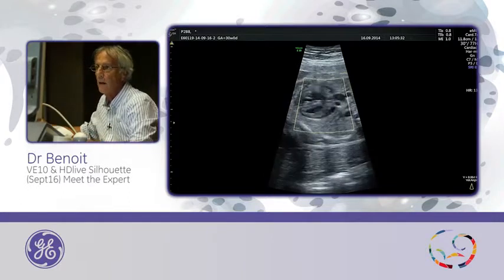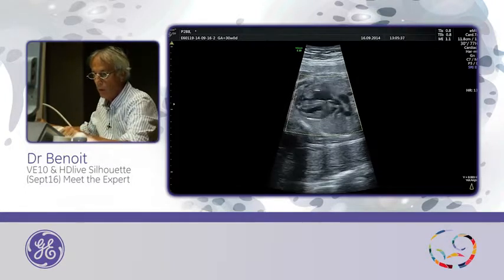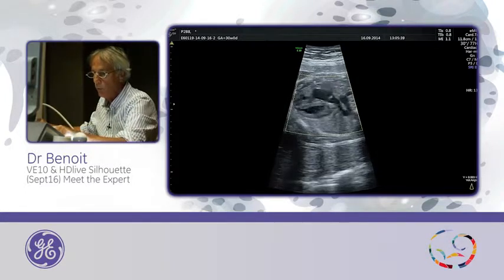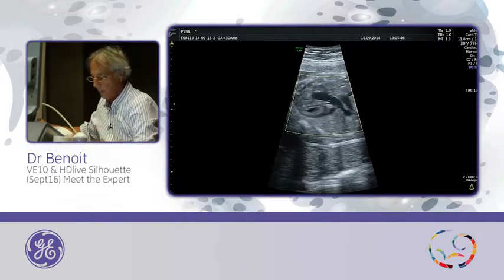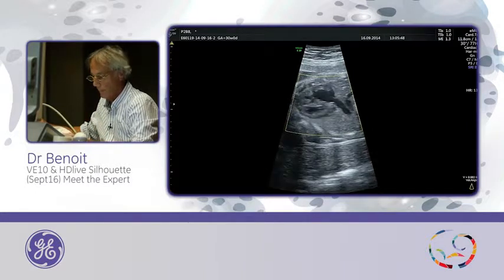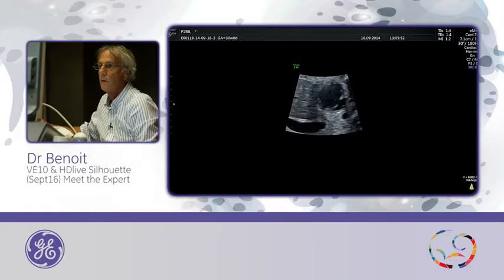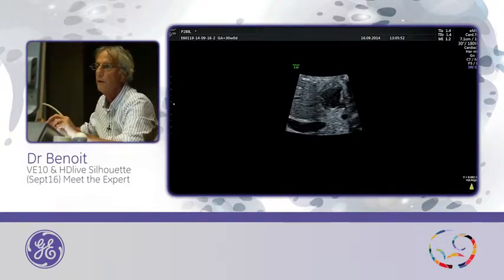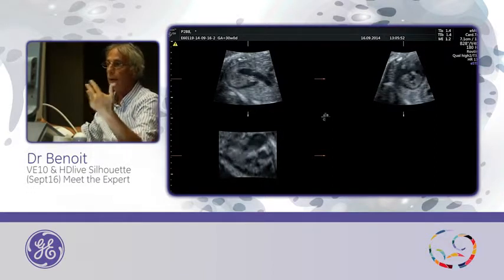You can do acquisition with a STIC, and now the name is e-STIC. With the e-STIC, the acquisition is quite fast. I will do it with quality I2. Volume angle, I will choose 40. Now I start. So this is the acquisition, and you will see the quality of the STIC. It's really good.